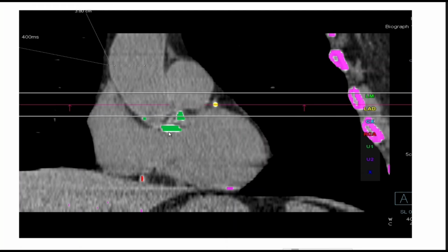So calcium, just so you know, the correlation between calcium and significant aortic stenosis: for men, a calcium score on the aortic valve greater than 2,000, and in women it's greater than 1,200. That correlates with about a 93% specificity of significant aortic valve disease by calcium.